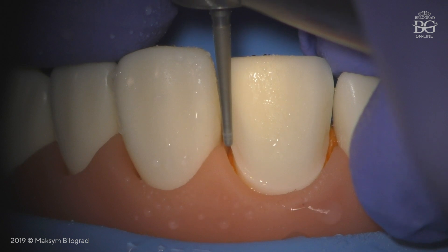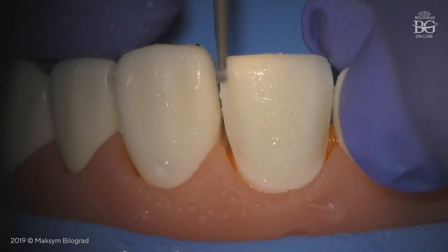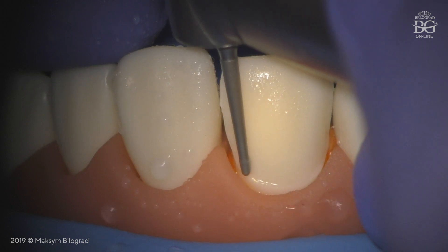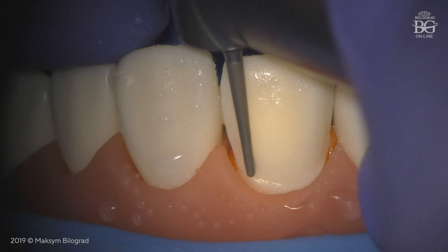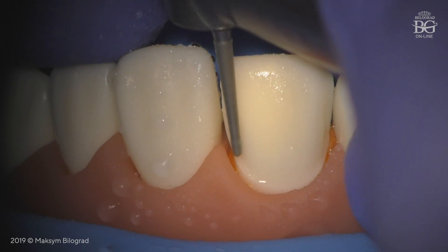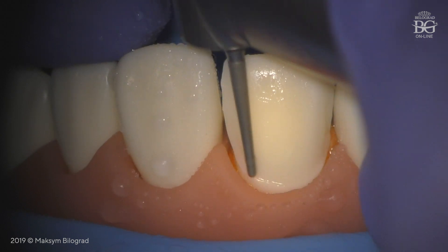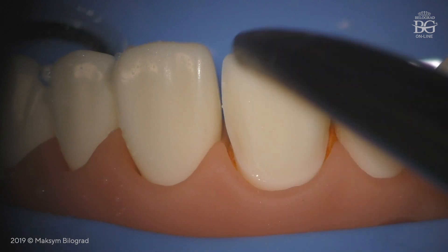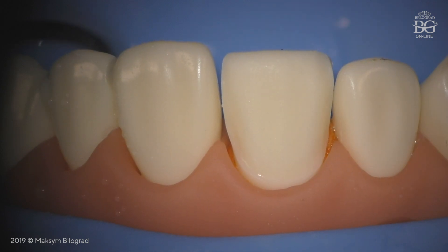If you take your bur vertically, or drive the tip of the bur inside or into the center of the tooth being prepared, you will get an undercut — as you can see now on the screen. In just a few seconds, I got an undercut that I will have to correct.